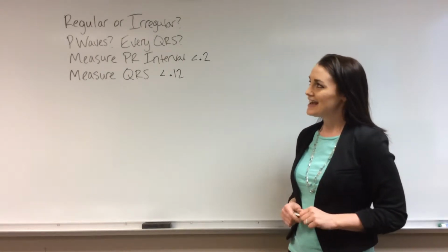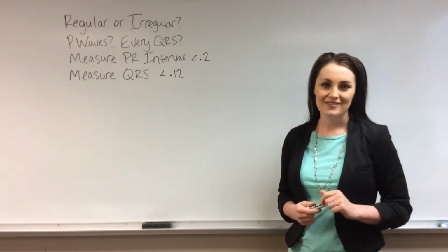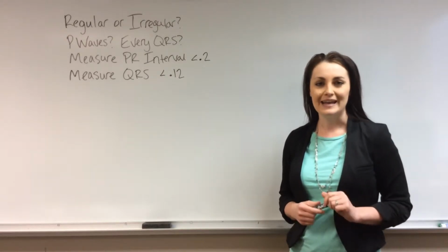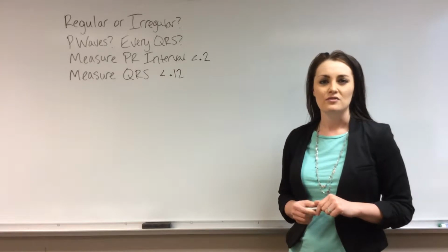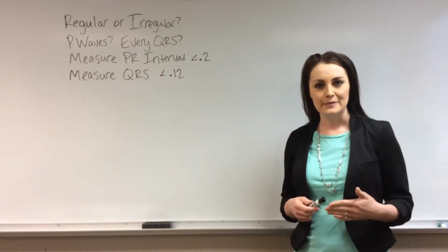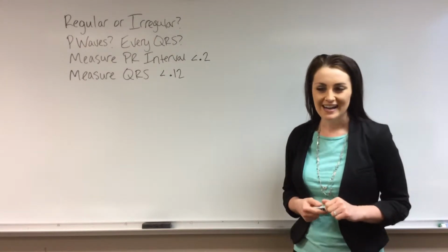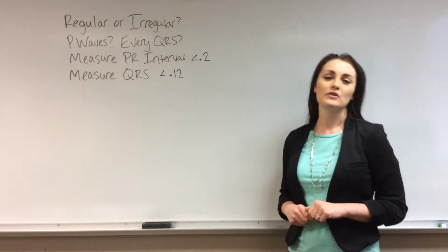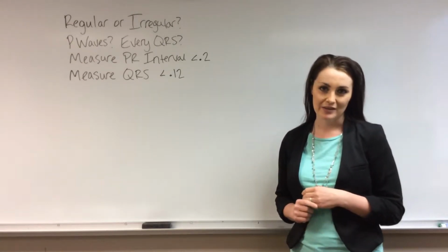And so today, as part of my practicum, I'm going to be recording 3 different videos on cardiac rhythm analysis. And so far, you have learned about the different rhythms and the different components of the cardiac cycle through lecture. And now today I'm going to be talking about my method of how I interpret cardiac rhythms.